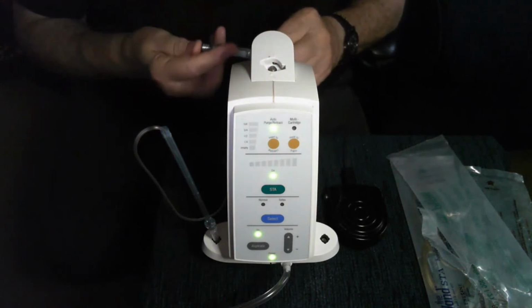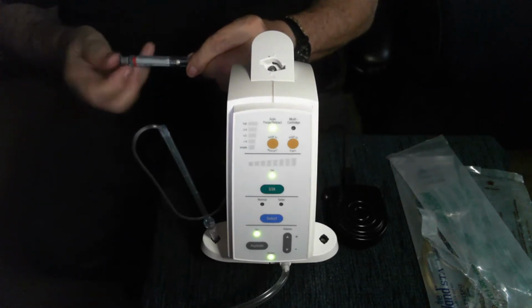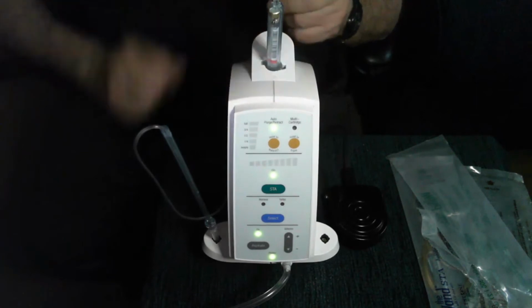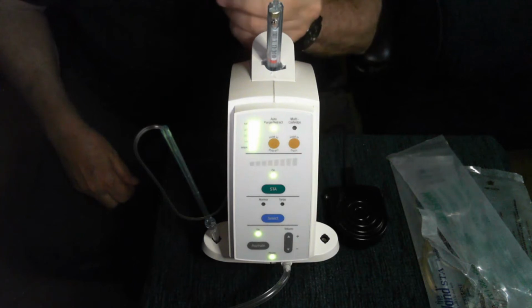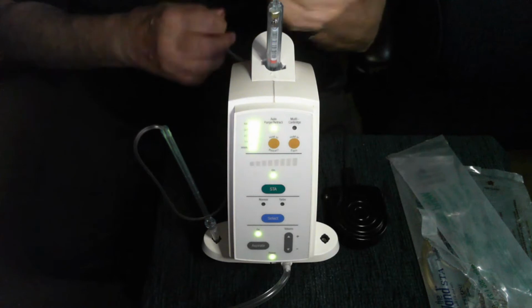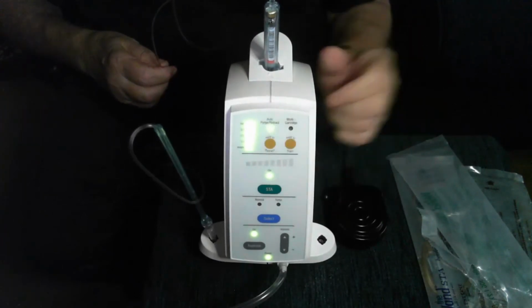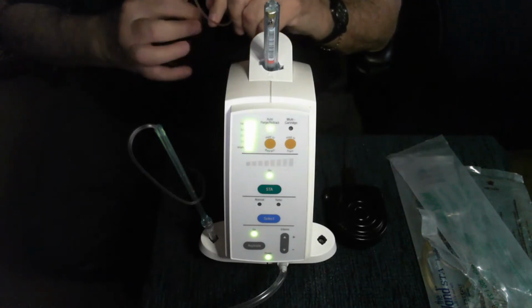So what we're going to do is pierce the membrane of the cartridge through the spike by just pressing. We place the cartridge holder on the top of the instrument. We press down, and then a quarter turn to the left, what that is doing is purging the air out of the tubing, and it's now filling it up with anesthetic, and we're ready to start to deliver the anesthetic. You can also see some lights come on, and these lights indicate how much anesthetic you've delivered, or indeed how much is still left in the cartridge.